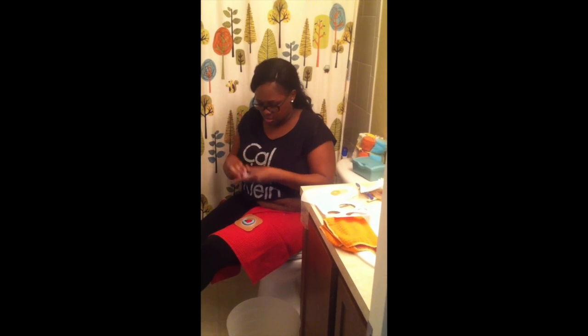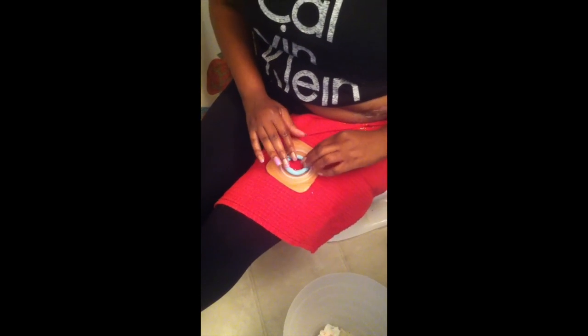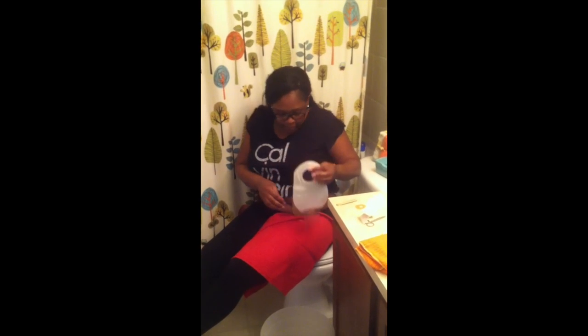As you can see it's not enough, so I'll have to get some more on there. So you create that nice seal to actually go over the stoma. More leakage? Yes. Just a little bit of saline over it, and you want to put it on like so. There you have it. I'm getting ready to attach the colostomy bag to the adhesive, and basically you just want to make sure that you clip it on there.